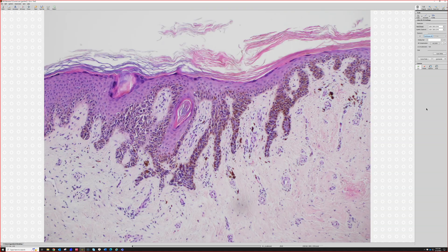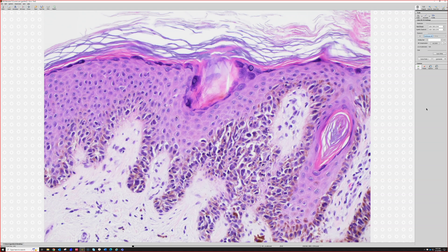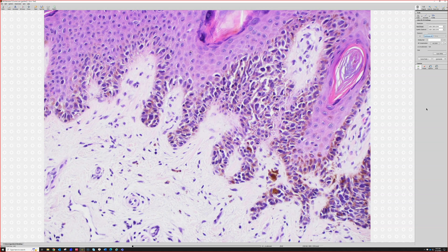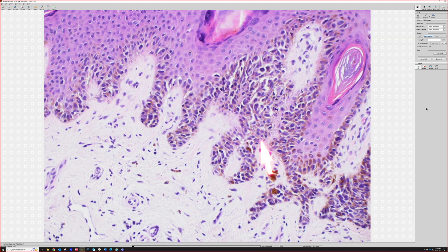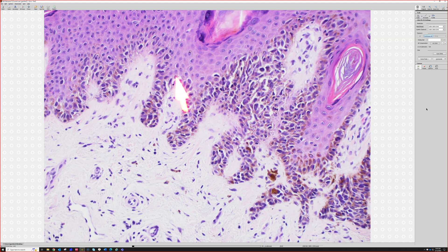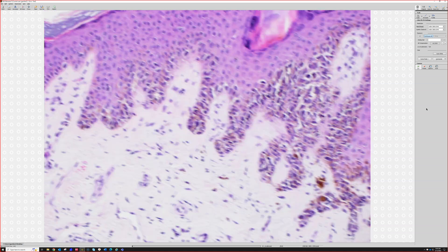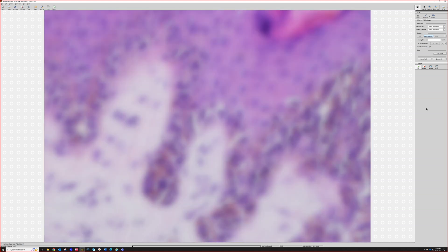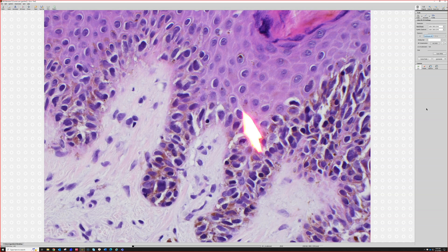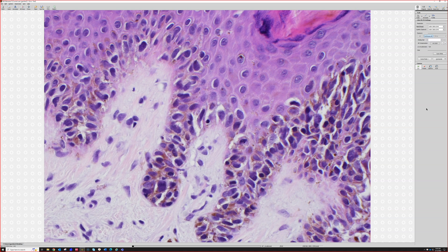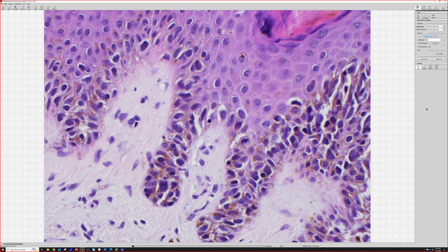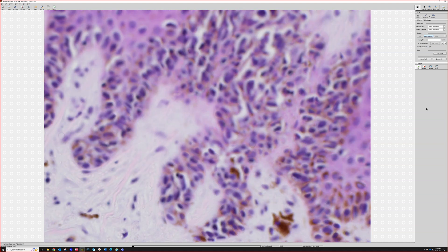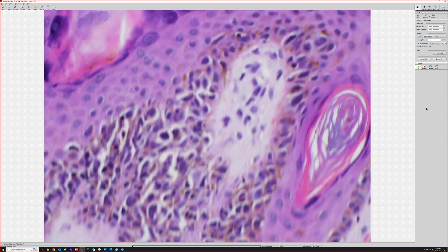We've got a lot of pigment, but also look at these very atypical junctional melanocytes. All these vacuolated cells are melanocytes — they're going up and down the rete ridges, they're confluent, enlarged, and atypical. We can even see a junctional mitosis in one of them right here. Sometimes it's hard with junctional mitoses to know if they're really in a melanocyte or a keratinocyte, but right here there are so many melanocytes it's probably in a melanocyte. They're very hyperchromatic — atypical and confluent.